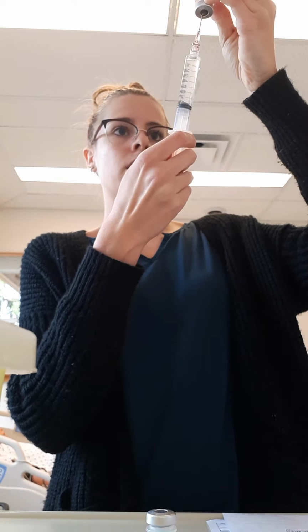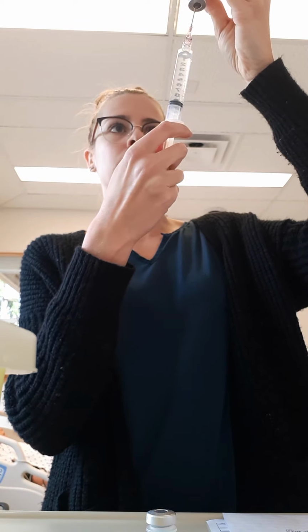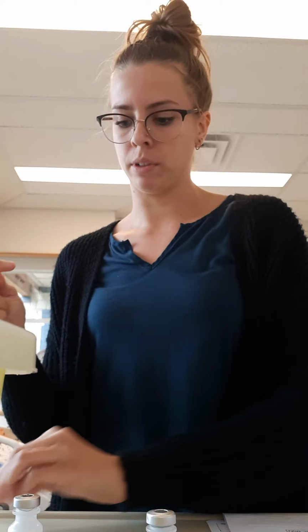Okay, good. So I've got my 9 mils there, and I've got a little bit of air, so I'm just going to aspirate a bit more normal saline and make sure I get that air out. Okay, so that's 9 mils there. I'm going to cap my syringe by sliding it on with my shaky hands.